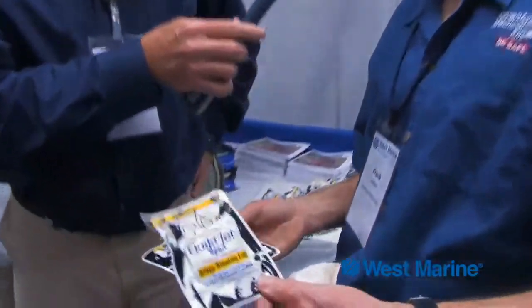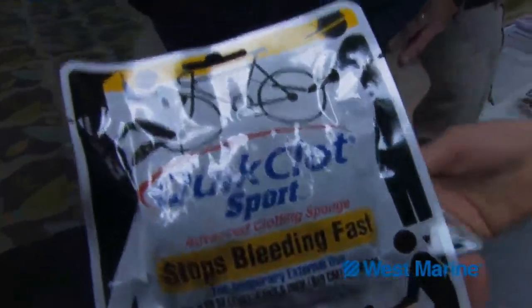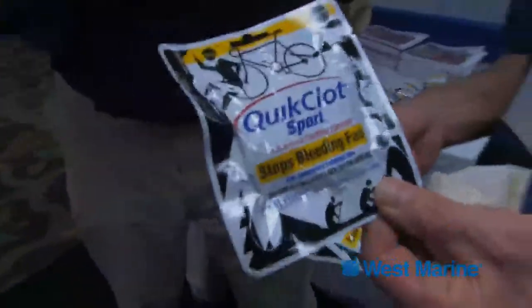Would you add this to an existing medical kit, or do you actually include this in some of your medical kits? This is so new on the market that right now we're selling it as an add-on, so you'd buy this in addition to your medical kit. Probably in the next couple of years we're going to start to put it in our medical kits. The Quick Clot looks like a good addition to any of your seagoing medical kits, and of course it's available at West Marine.